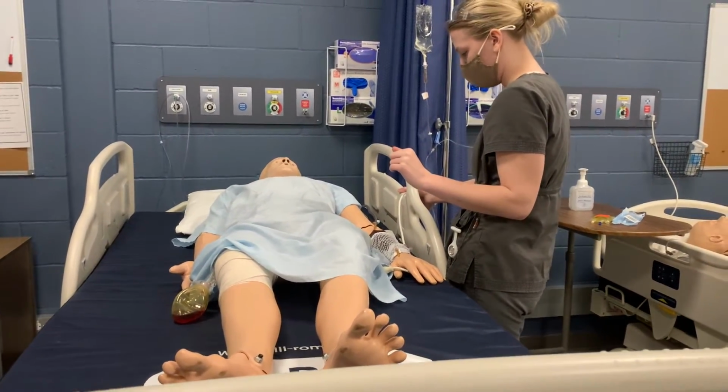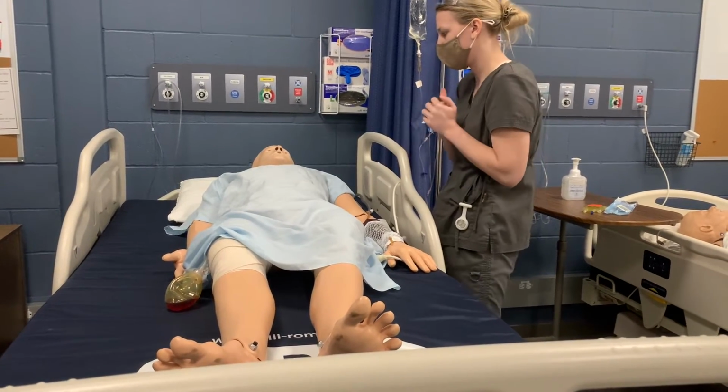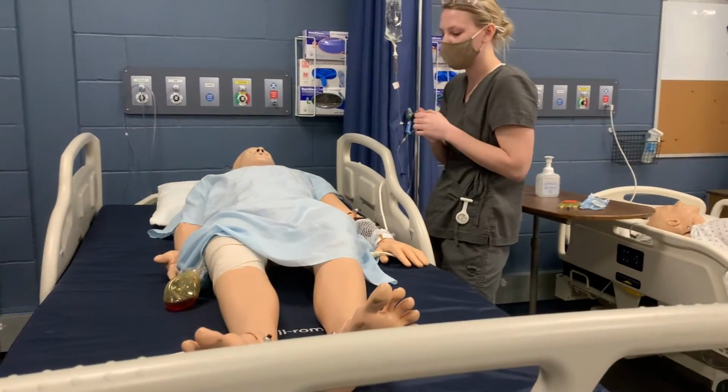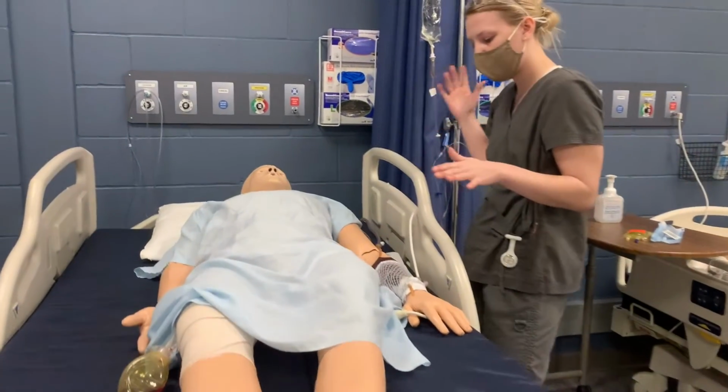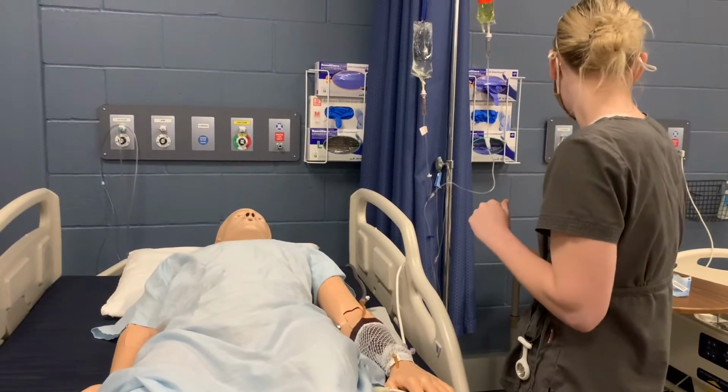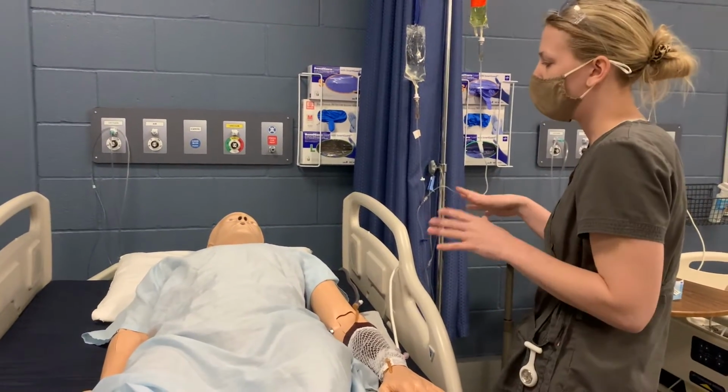Wonderful. And do you know why I'm here today? No. So I'm just going to be giving you your IV antibiotics. So since you did just get surgery, we like to err on the side of caution and give you an antibiotic just to be on the safe side of things. So today you're getting cefuroxime. Do you have any questions at all?